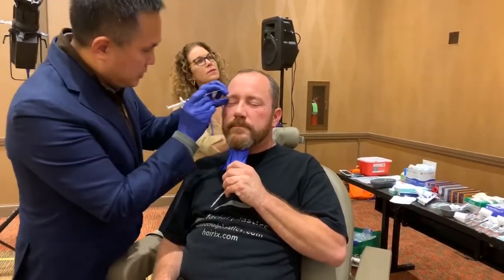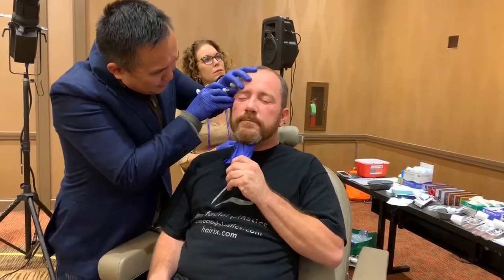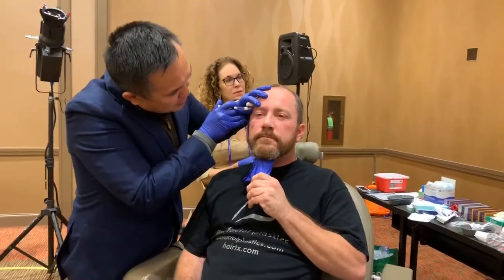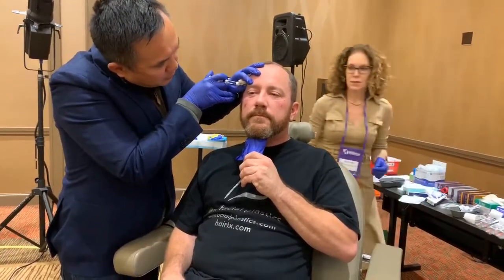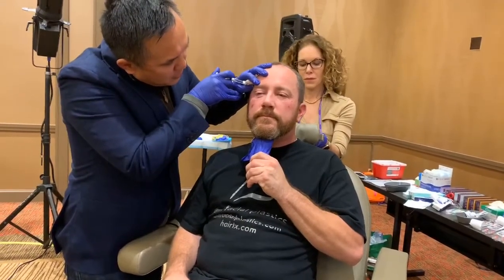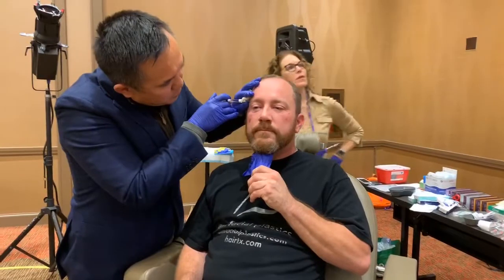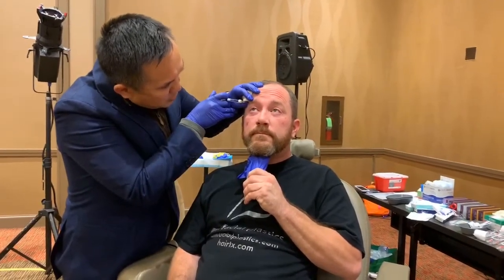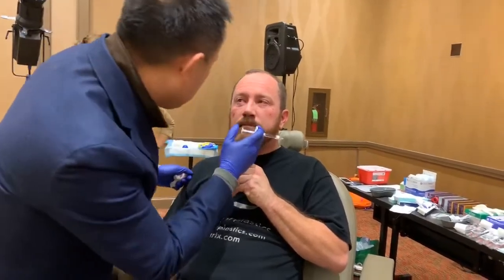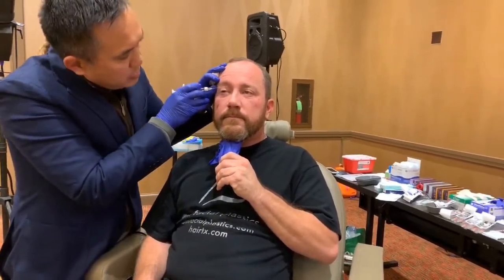Attacking this inner part first — the A-frame. Eyes closed. The way to minimize discomfort here is to go in and then over, not just straight over. Eyes open, look straight ahead — very slow injection here to be safe. I use very dilute product placed very carefully. When you fill this area it can sometimes look a little bunchy, so I warn the patient I may be doing a lot of massage. If they haven't had full Botox, I have them lift their brows up to see areas that look bulgy and blend while the brows are up and down.